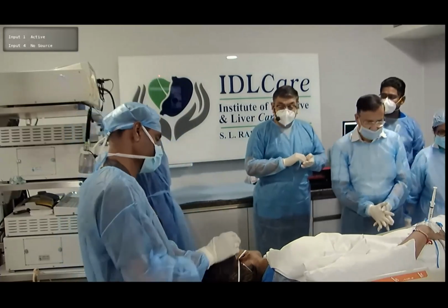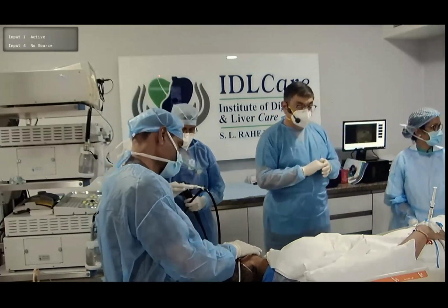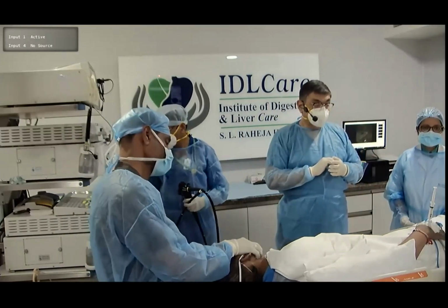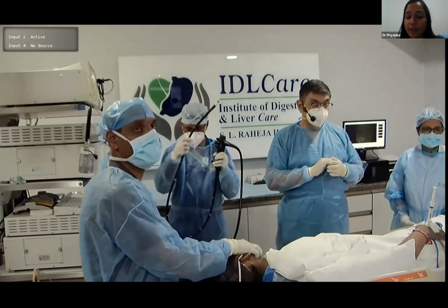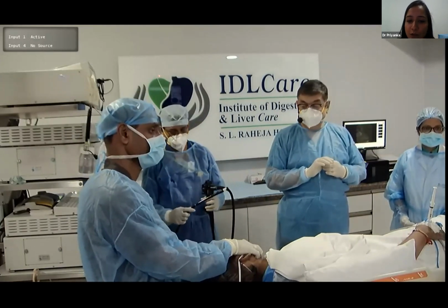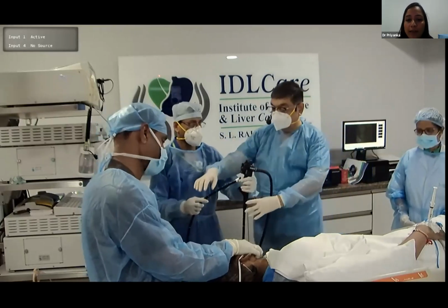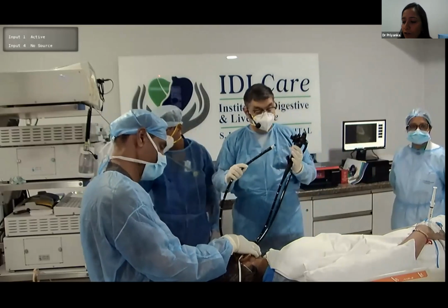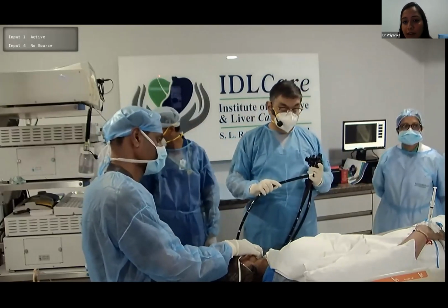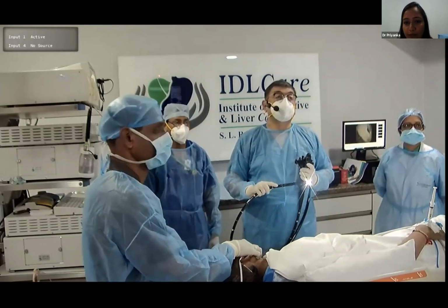So this is a young boy. Priyanka, you have the case history? Yes, sir. So he's a 35-year-old male with 4 weeks of abdominal pain. There was no history of fever or weight loss. There was no history of jaundice. And ultrasound showed some lesion in the head of pancreas. And CT showed a heterogeneous lesion in the head of pancreas and uncinate process involving the neck and body of pancreas.